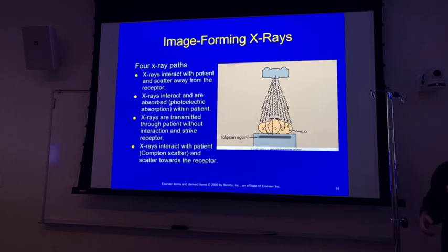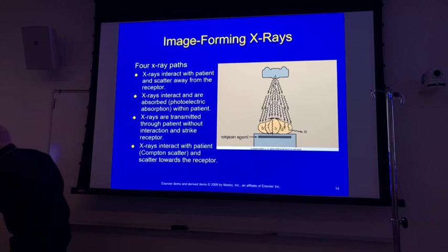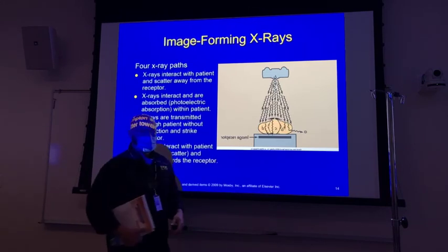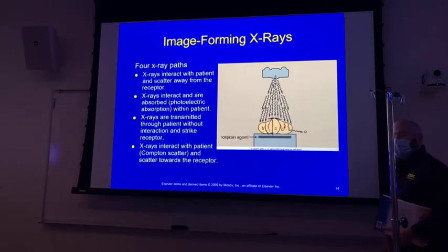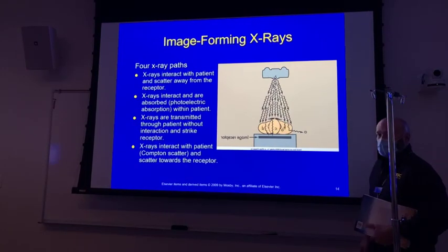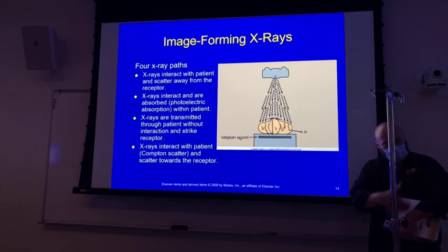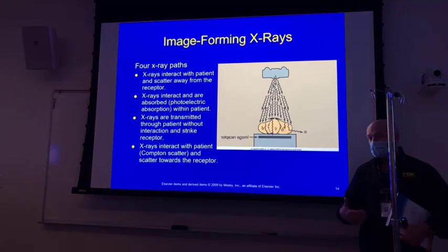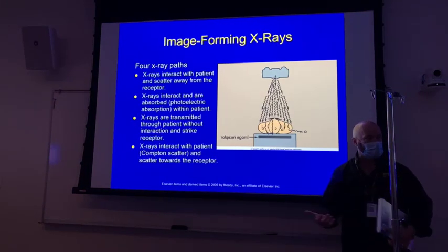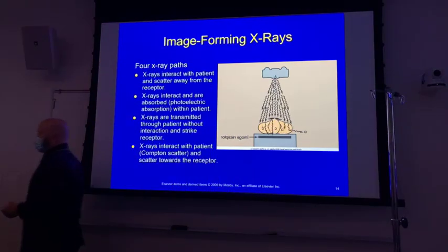So he's holding the PA in his arm, in his hand, like you would carry a textbook, right? So he's holding it like this. So shoot the lateral, and he goes in and develops it. And whenever we take a look at the PA and the lateral both, we can make a diagnosis of fracture on his arm off of that x-ray because you can see from the scatter radiation his bones in his arm.